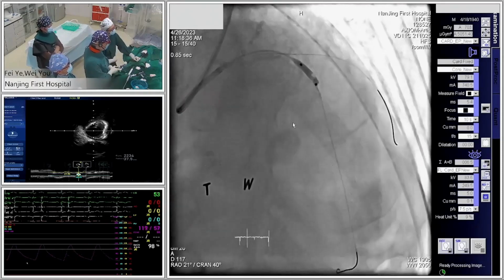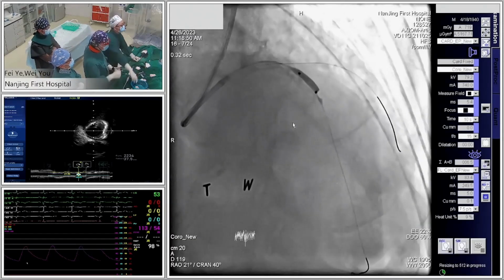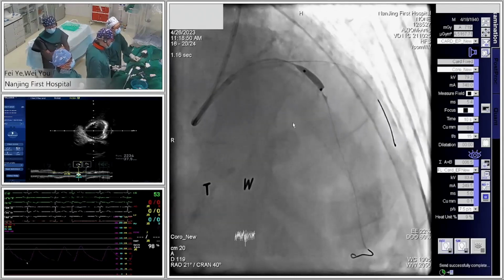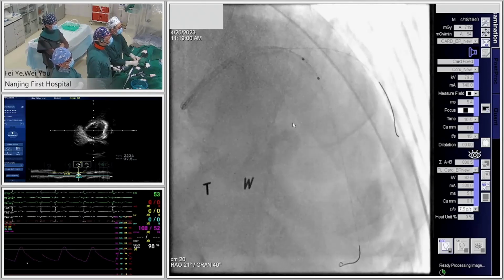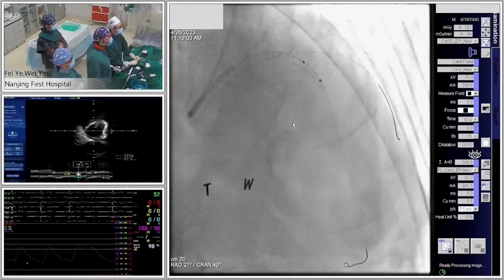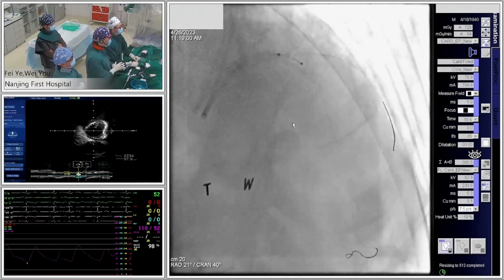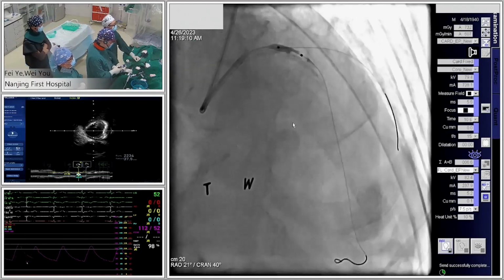So after preparation, we should use IVUS to check again. If we find the calcification fracture phenomena, we can stent. Okay, Chief, we have finished the 4th round. Okay, last round. Here is very important to prepare the bifurcation site.